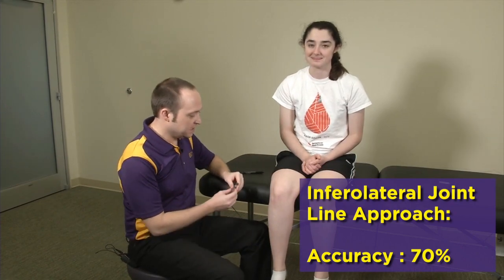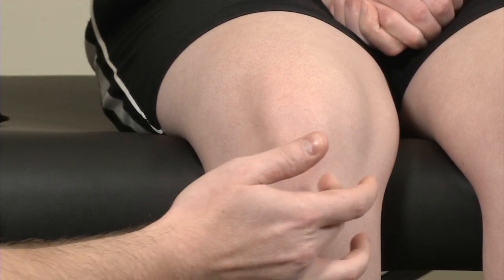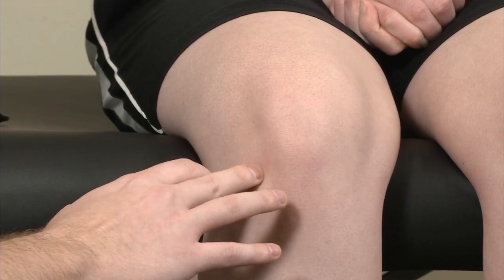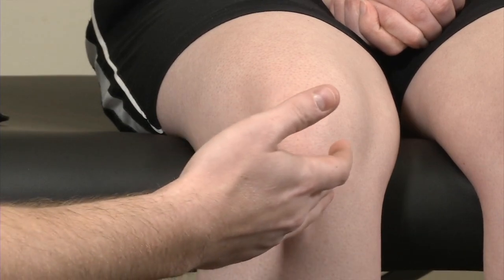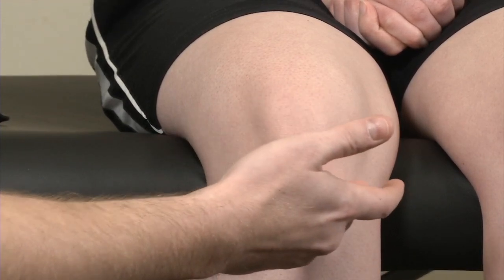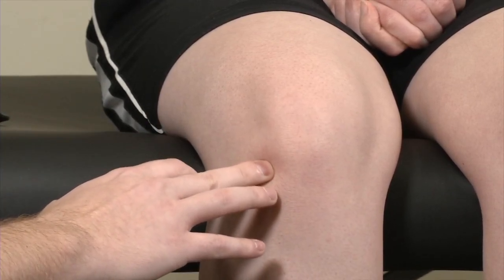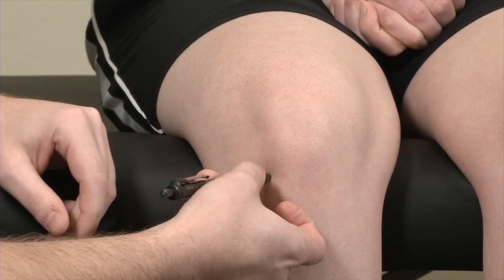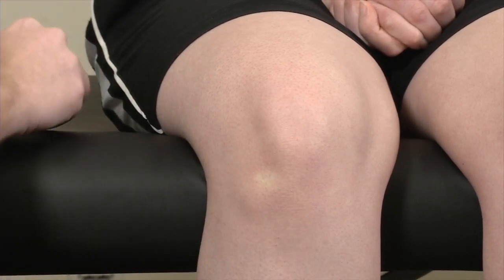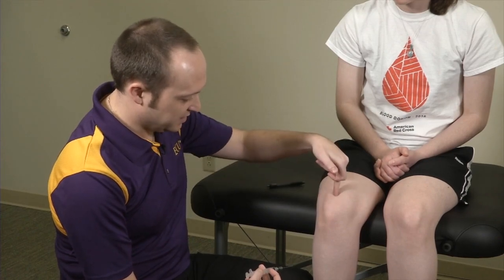Finally, we're going to be doing the inferior lateral approach to get into the knee joint. There are two sulci on either side of the patellar tendon, and while you can get into either one, it's generally considered a little bit less painful to get into the inferior lateral approach. Depending on your patient, if they tend to have more osteophytic change or more medial or lateral compartment involvement, you may end up going on one side versus the other. But for this demonstration, we're going to be using the inferior lateral approach. Just like before, you can use your pen without the tip out to create a little divot, and then you're going to clean the skin. Your angle of approach is going to be essentially aiming for the center of the knee joint.